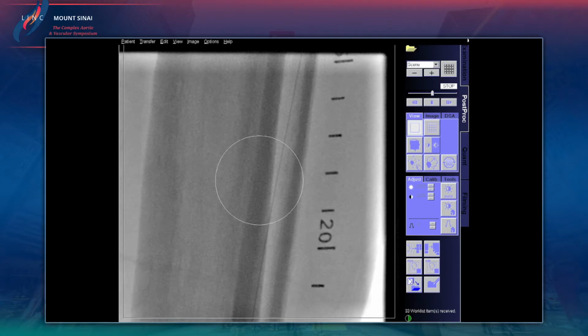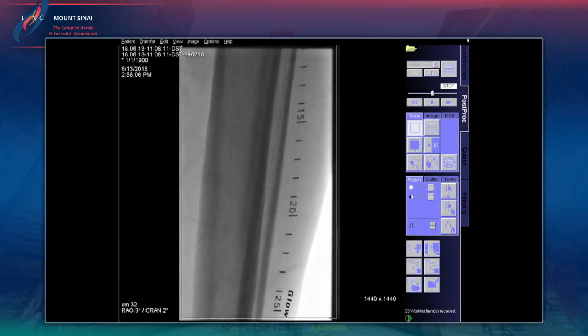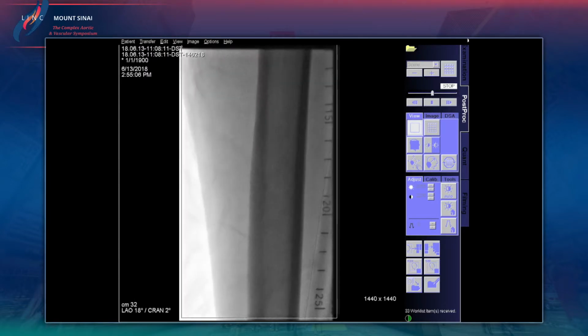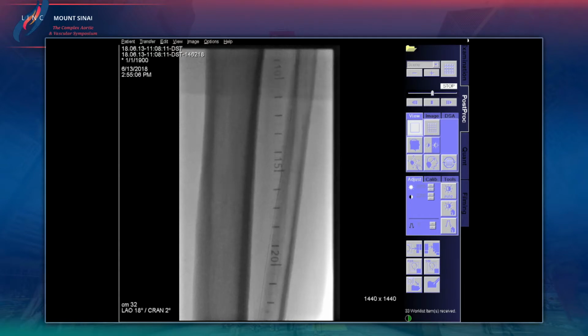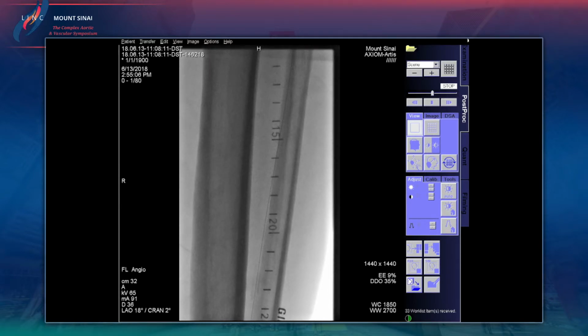So we were discussing before about this low-flow situation, and do you not fear that there is any issue with the atherectomy system in such a patient, that you have distal embolization or whatever? Because this is always the argument of people who vote against atherectomy. You just have to be careful. I don't think the problem is... filters haven't really been effective in terms of below the knee, so we really don't use filters below the knee. I think it's the technique of atherectomy that's very, very important. Really slow passes.